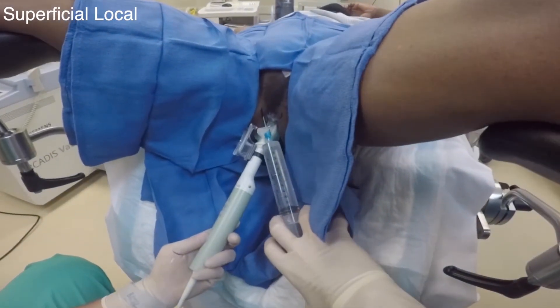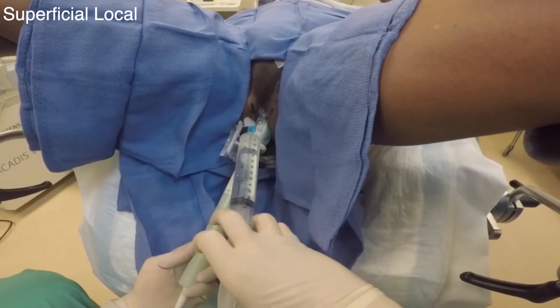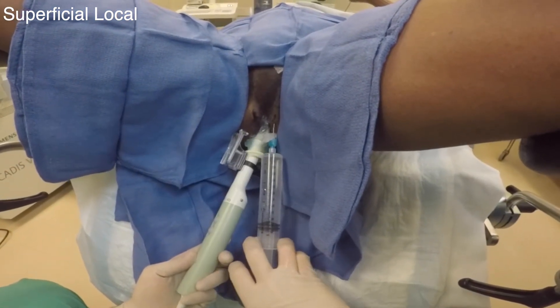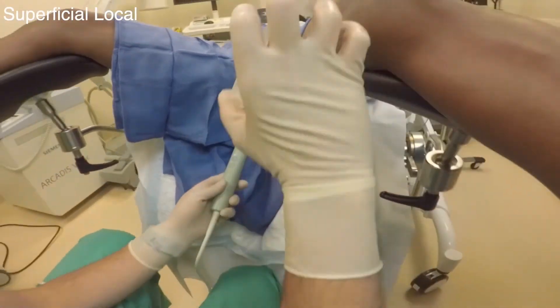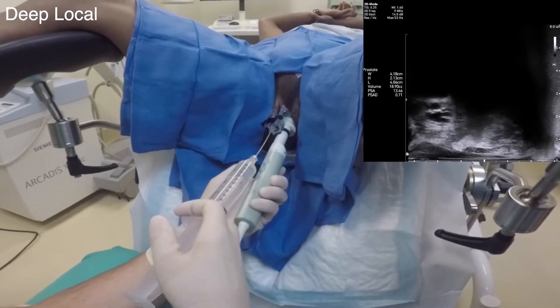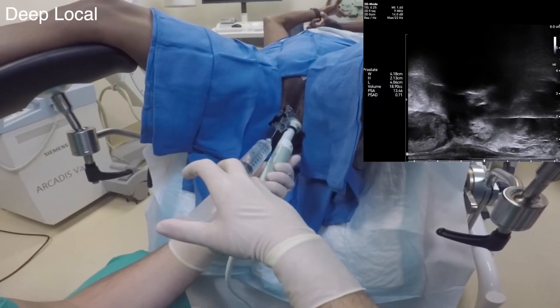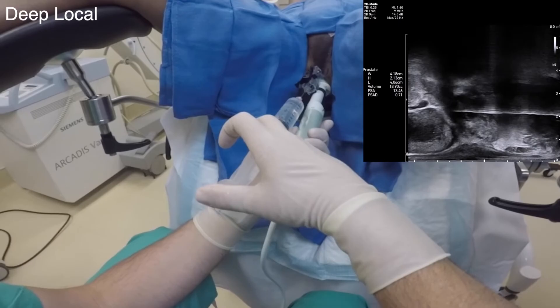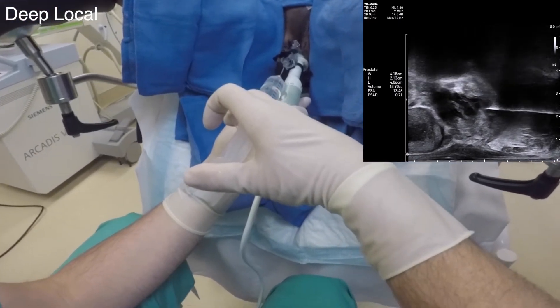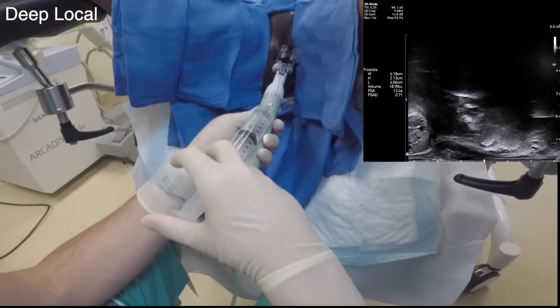Superficial local anesthesia with 1% lidocaine without epinephrine is first applied. This is followed by deep tissue anesthesia: 15 cc of 1% lidocaine without epinephrine deep to the pelvic floor muscles at the prostatic apex bilaterally. No posterior or perirectal block is needed. Special attention should be given to block the apical region.